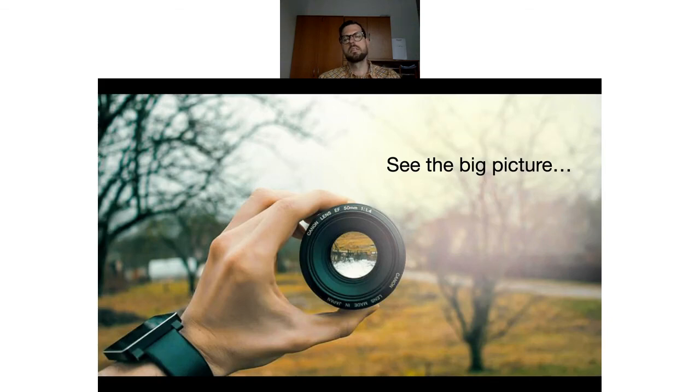Another thing is that when you have a picture or image, and it doesn't matter if it's X-ray or 2D or 3D or a panoramic one, if you do endo, don't look just at this one thing, but always look at the big picture. So check everything.